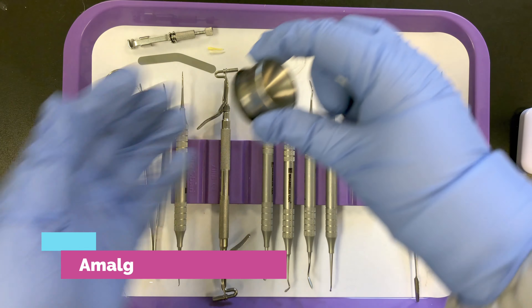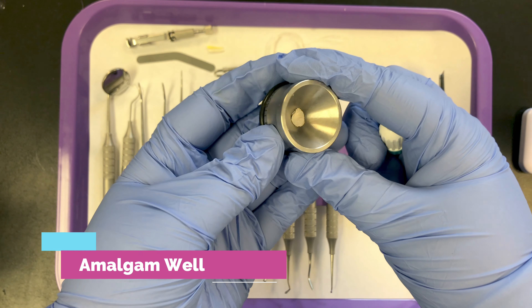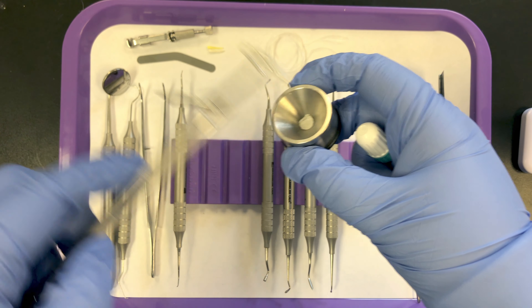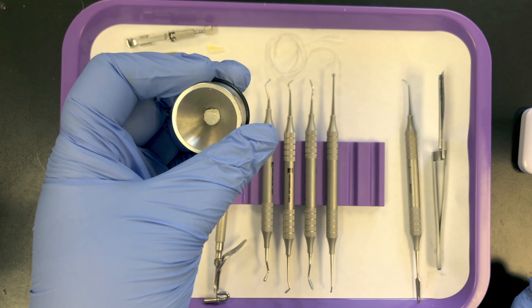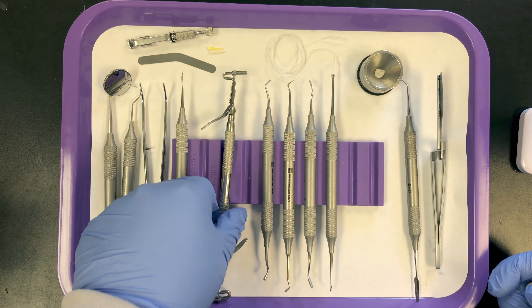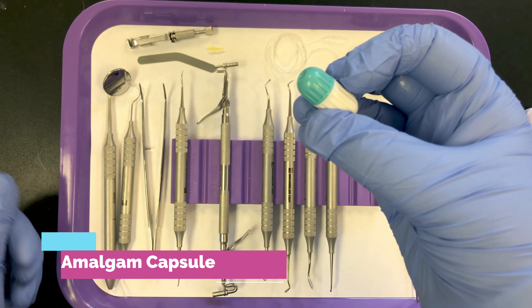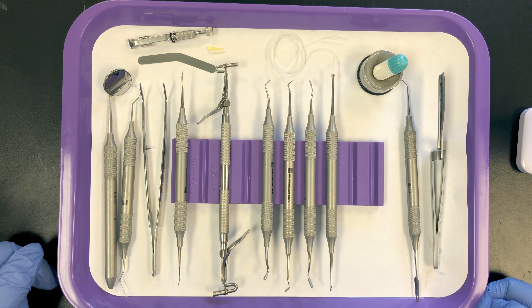The amalgam well right here is where we place the mixed amalgam. Once we triturate the amalgam it gets placed in this well, and then we scoop the amalgam up into the carrier using the well. Not all offices use an amalgam well — some use squeeze cloths, where they place the mixed amalgam onto a squeeze cloth and press the carrier into it. This here is an amalgam capsule, which goes into the triturator to get mixed, then we load it into the carrier and pass it to the dentist.